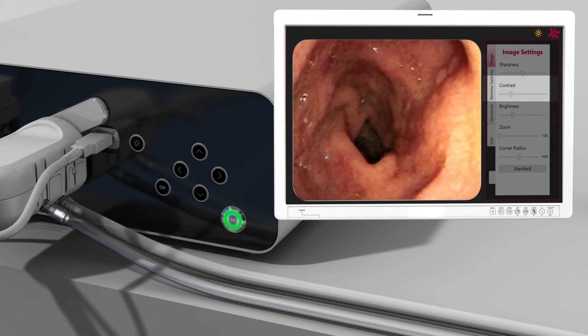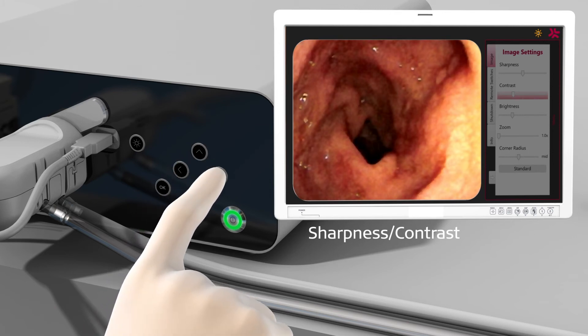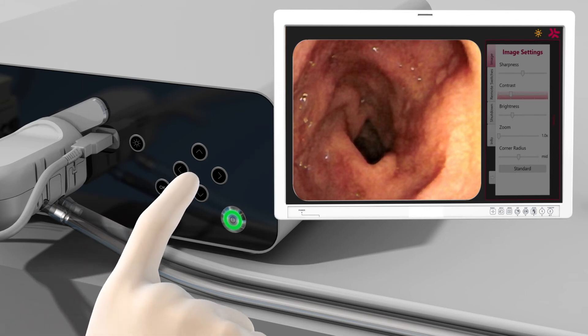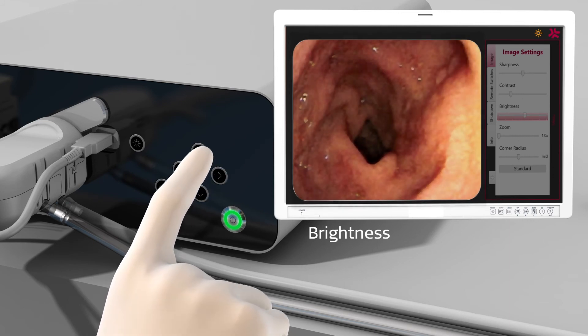The following parameters can be set from the image submenu: Sharpness, Contrast, Brightness, Zoom, and Corner Radius. Adjustments to Sharpness and Contrast will be effective immediately and should be verified while the camera image is visible. Pressing the right arrow will increase the selected property; conversely, pressing the left arrow will decrease it. Press OK to save your settings. When adjusting brightness, it is recommended to start with the default value at the midpoint of the range. Choosing a lower value results in an overall darker image, whereas a higher value results in an overall brighter image. Automatic light control is maintained by the A-Box Duodino.